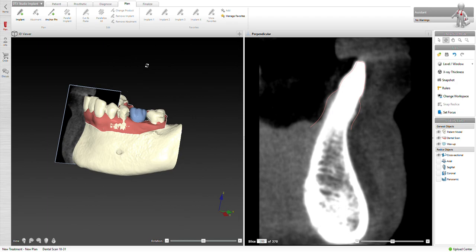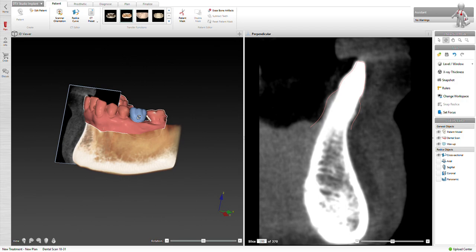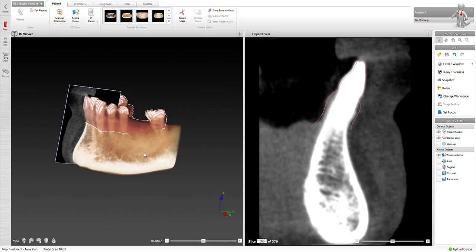Alright, we're going to go ahead and hit finish. We're happy with it. We're going to pick the view. I happen to like this view, that's just personal preference because I can see the roots. I'm going to remove the wax-up and go over and do it here in the visibility editor. I can remove the dental scan too as well, just to show you. I want to increase my visibility, so I right click on where I want to be at, hit transparent, and that makes it transparent.